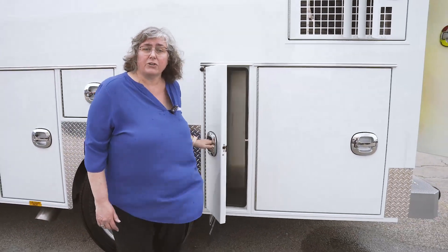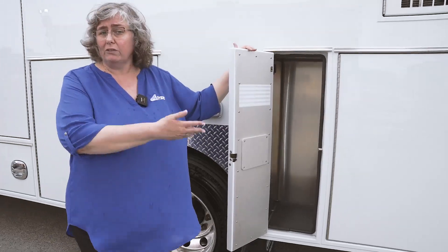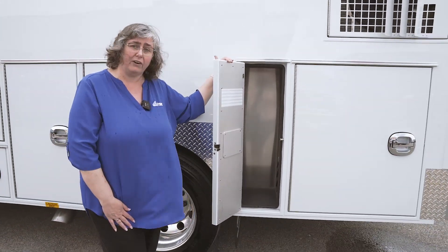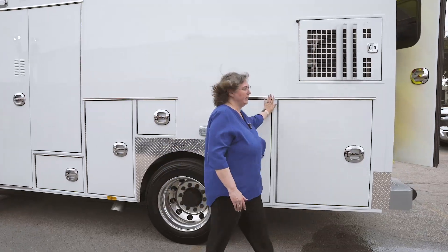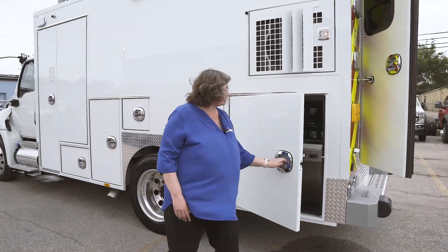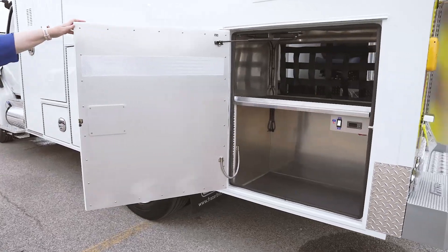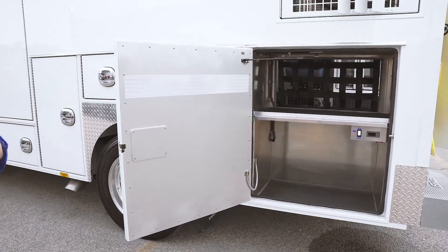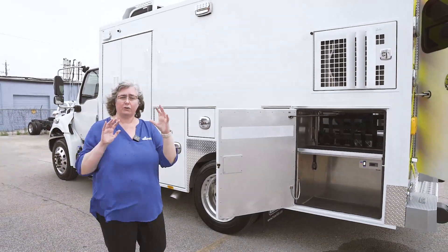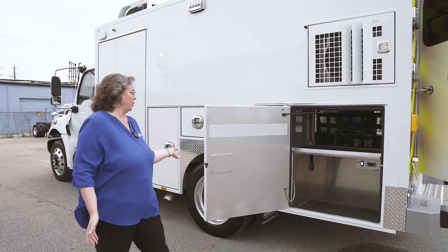Next, we have our stair chair storage. If you don't use the stair chair, that's fine — you've got extra storage. But if you need to carry one for your community, this is where it would go. And last, we have an inside-outside rear storage compartment. This gives us compartment storage on the bottom and access from the inside on the top, so that you can use it as you would normally use an inside-outside ALS compartment.